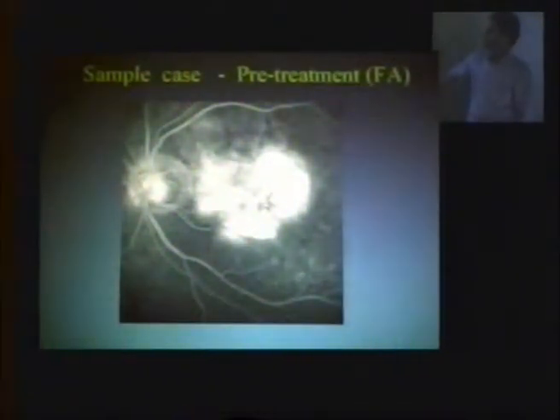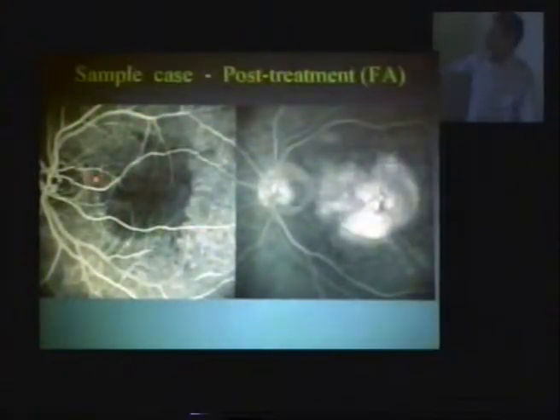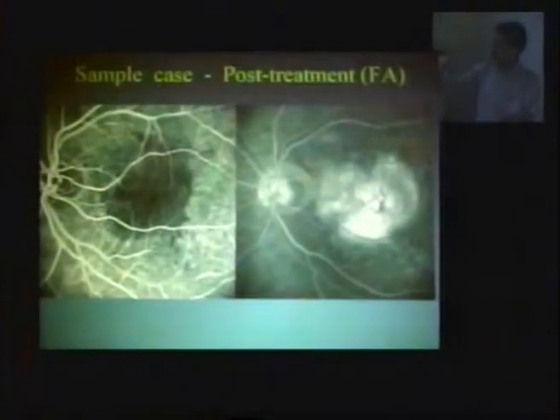This is late stage, but I have an early stage of this fluorescein. I don't have it here. Let's say this is it. It's easy to make a drawing with a pencil on here where the feeder vessel is. There are 2 methods of doing it. Number one, the simple method is taking the ICG picture, the fluorescein picture, and looking and saying, okay, it's over there. The more expensive method is to ask the photographer to do it on a computer. Both methods are good.